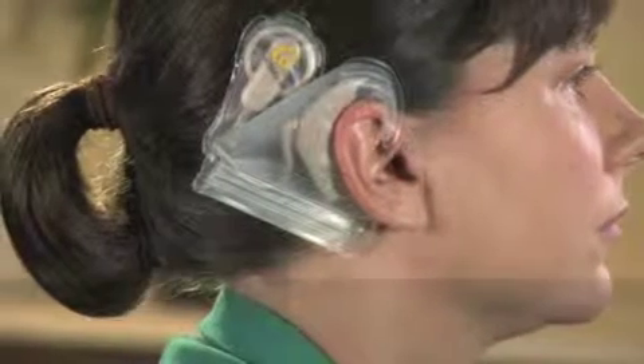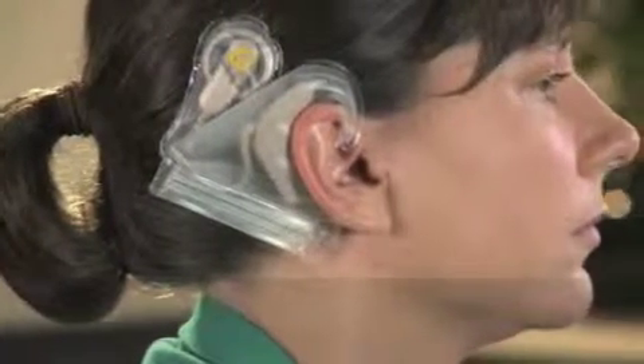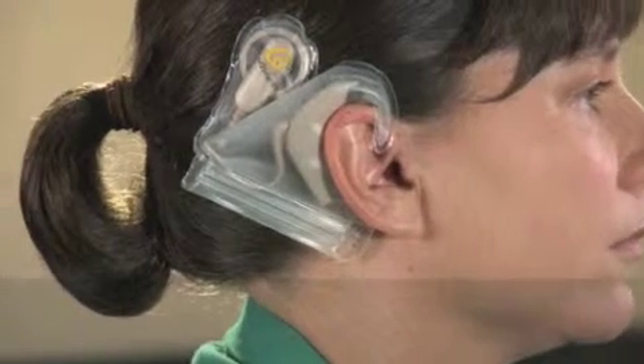The clear, flexible plastic makes it possible to still have access to the buttons on your sound processor. It's designed for use with rechargeable batteries only.